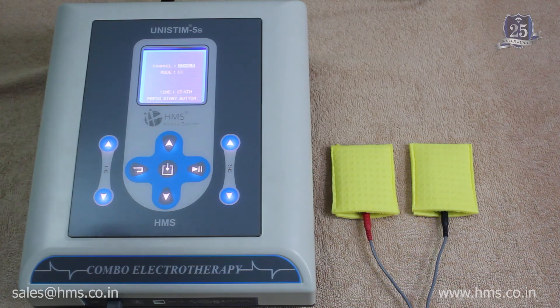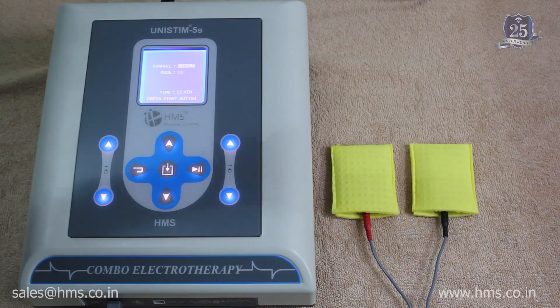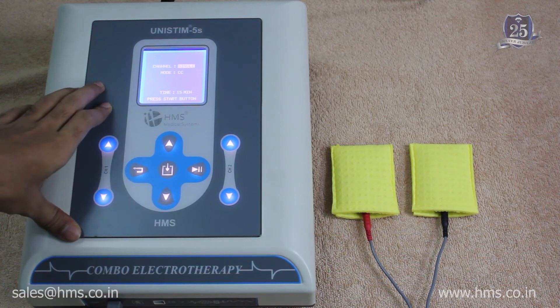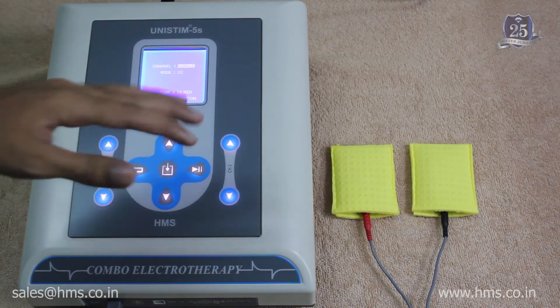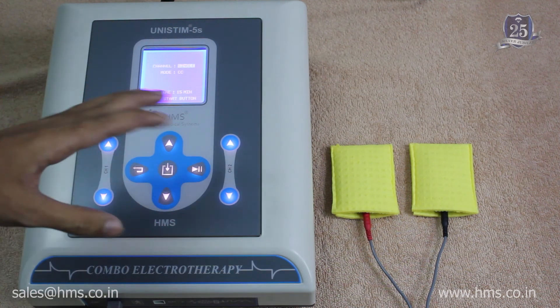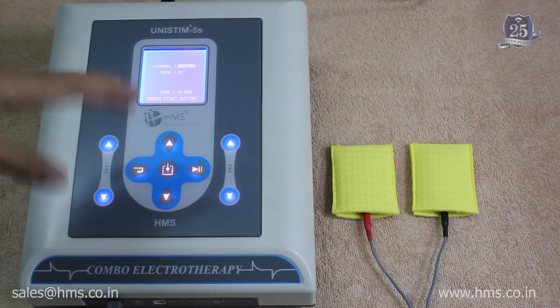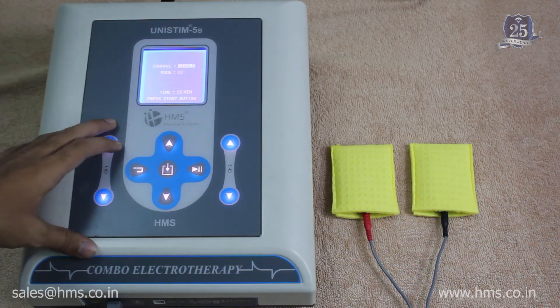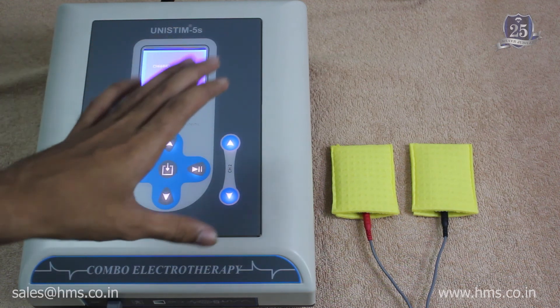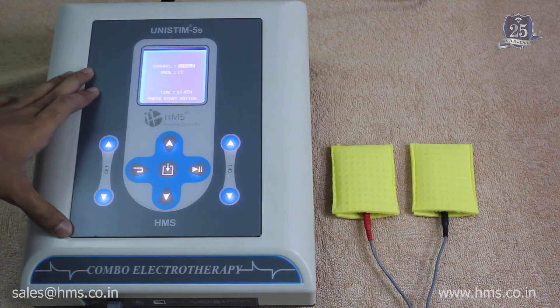The auto sensing feature works as follows: whenever the electrode does not detect contact with the skin, the machine will stop the treatment. Only after the electrode makes contact with the skin again will the machine resume treatment. This prevents a sudden surge of power to the patient whenever the electrode is not in proper contact — a feature not available on other brands' machines.